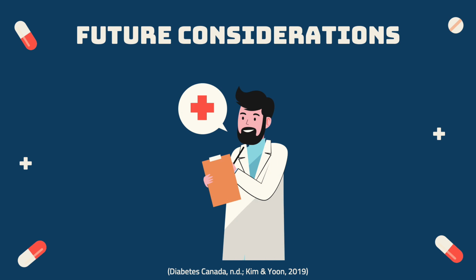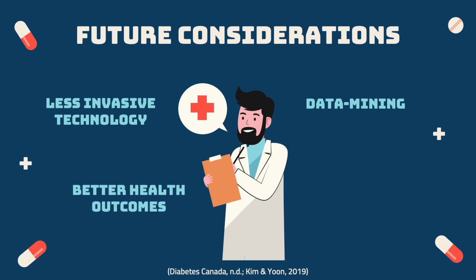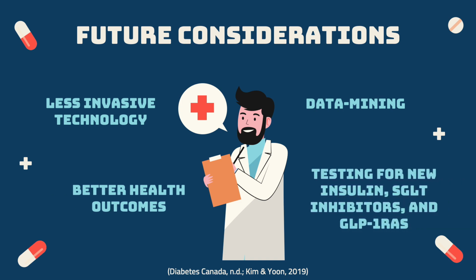With high patient adherence rates, continuous glucose monitor developers propose new algorithms will be able to identify individualized blood sugar patterns for each patient. Accumulated patient-generated data combined with data-driven feedback from medical practitioners is being used to enhance the software found in these medical devices. Sensors are being tested to collect blood glucose levels through contact lenses, sweat, breathing, and tattoos. Information collected about patients' eating habits, sleep, and exercise contributes to artificial intelligence found in medical device software.